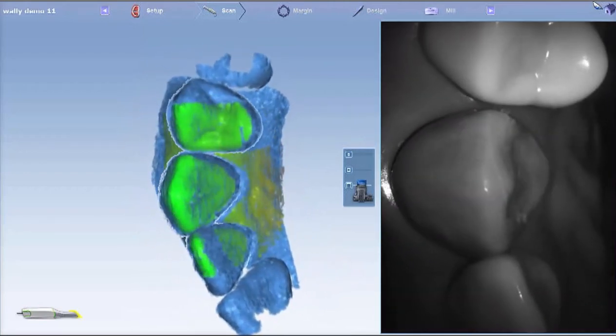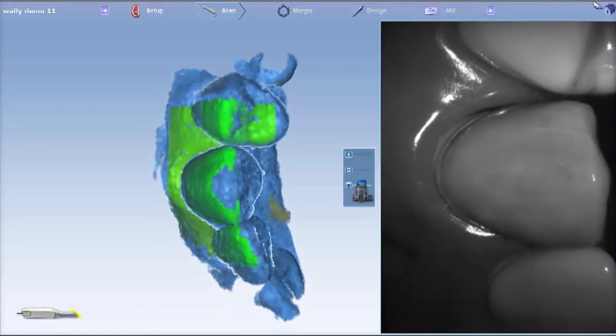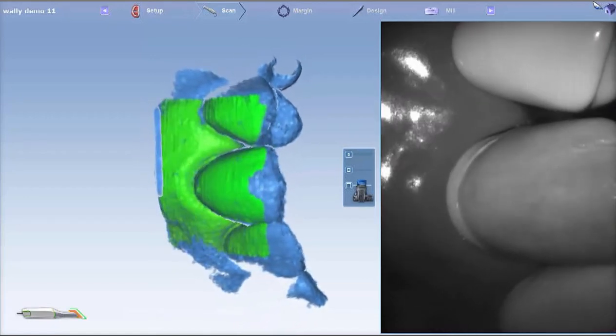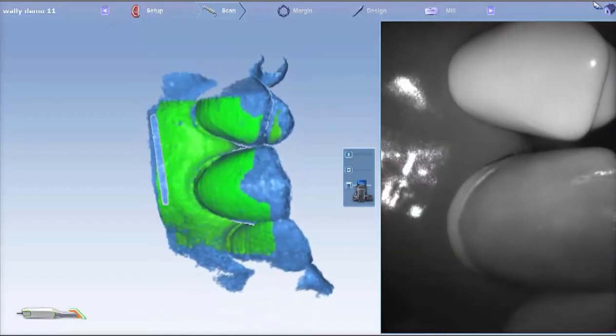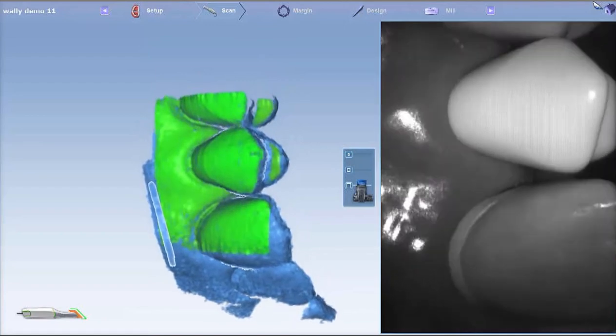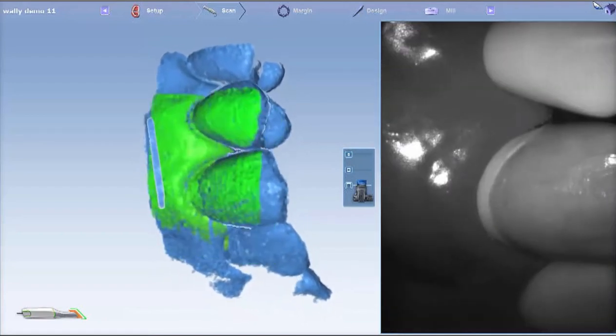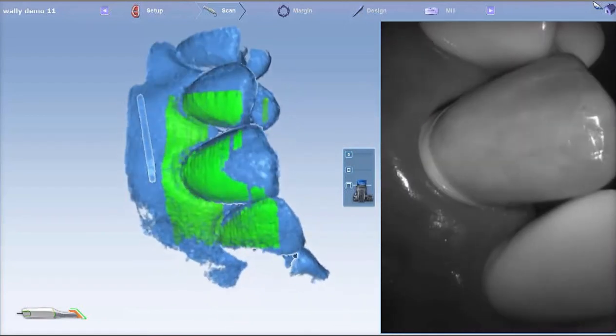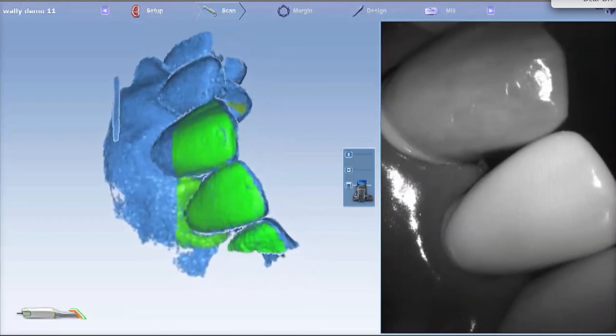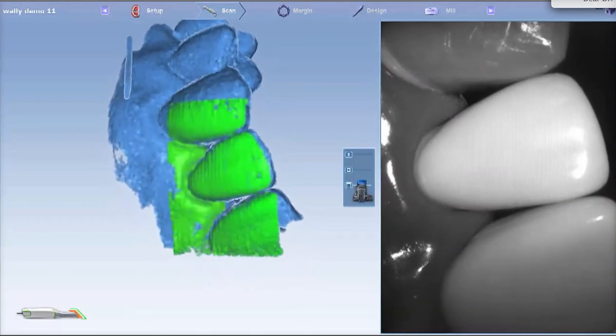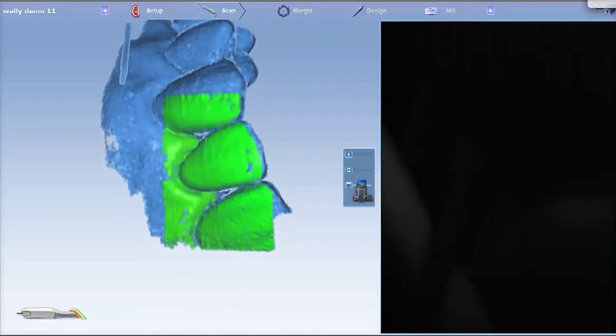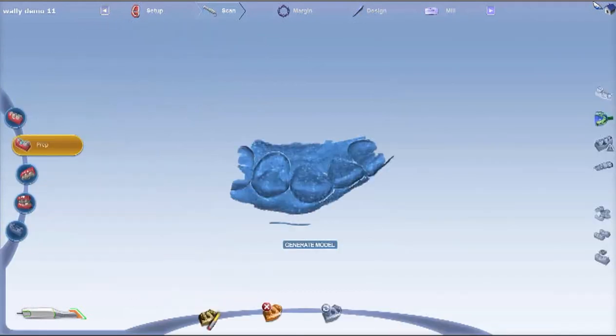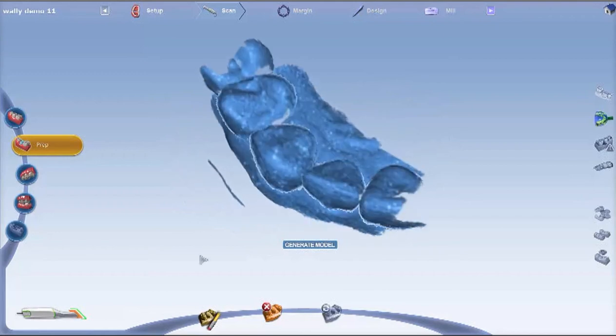Finally, I'm coming down to almost a flat 90-degree angle there on the facial surface, trying to rotate into those embrasures mesially and distally. Check for any extraneous data like lips, cheeks, fingers, anything like that, and go ahead and erase that.